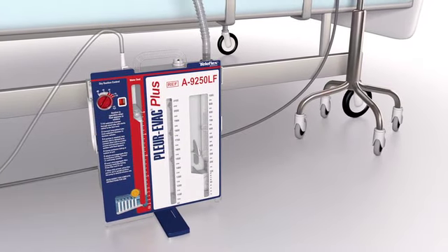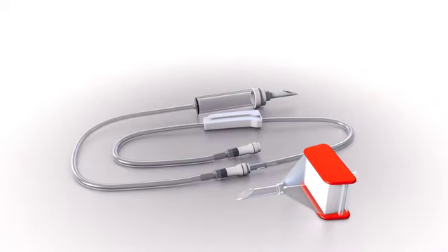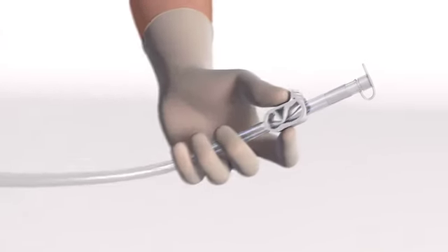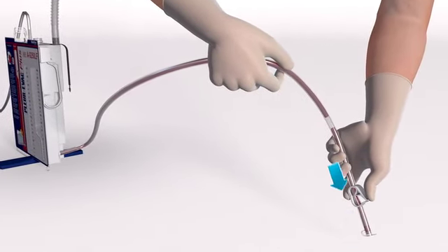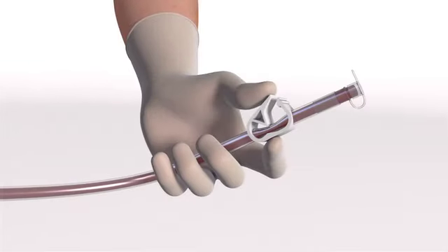To begin continuous re-infusion of autologous blood with the Plurivac A9250LF or S1150-08LF, start by setting up a blood-compatible IV pump. Obtain a microaggregate filter and an administration set for use with that pump. Prepare the re-infusion tubing for connection to the microaggregate filter and administration set. Be sure that the clamp on the Plurivac re-infusion tubing is open and the tethered exit port cap is closed. Hold the tubing below the bottom of the Plurivac device and gently milk it until it's filled with blood and free of air. Then close the clamp to temporarily stop blood flow.